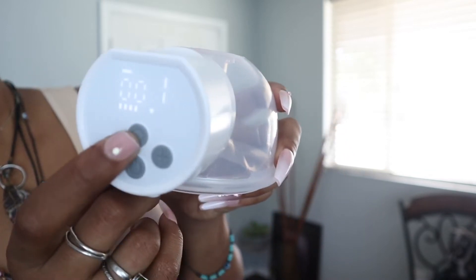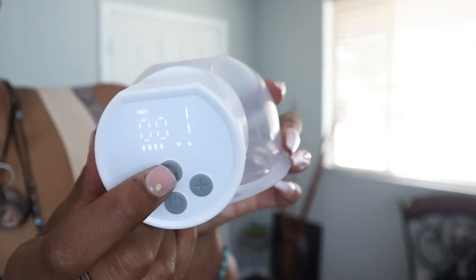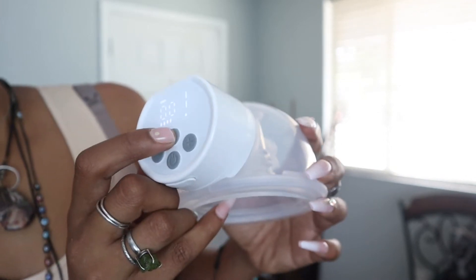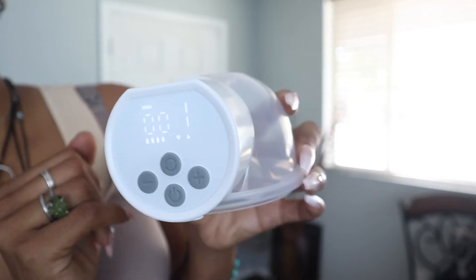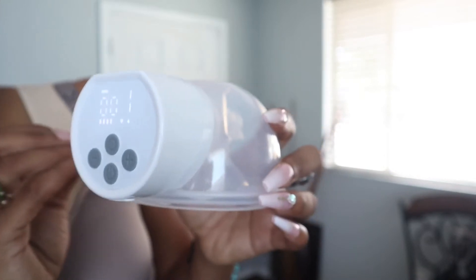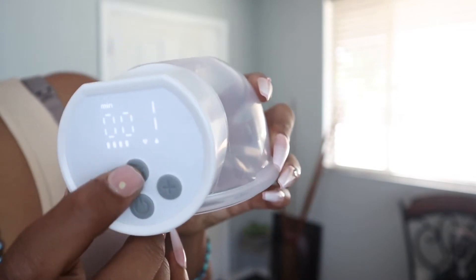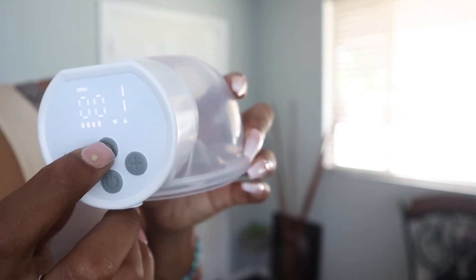And then you have three different modes. You have stimulation and you have expression. And then you can do them together as a mixed option — it does both at the same time. You guys can see that little drop and the heart icons: one, the other, or both. Really cool setup.